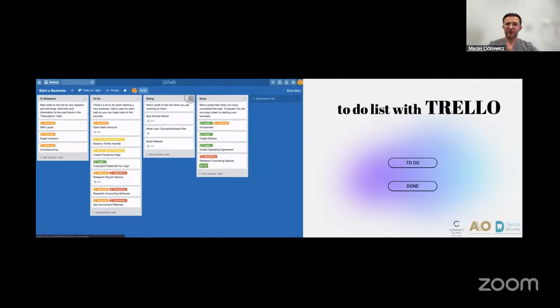And then during the to-do list, we finalize with the additional treatment or with additional elements of the treatment, like additional data, like OPG or CBCT, etc. If we finalize the elements with the production, then we can click done, because sometimes the treatment or the animation has to be discussed with other doctors, and communication goes on, we have to postpone, and then it is going in another direction.